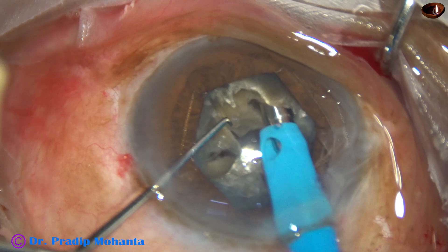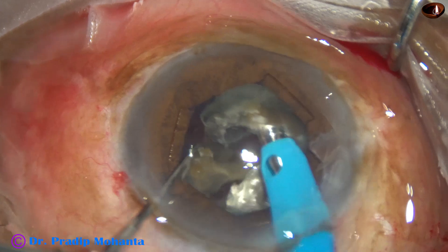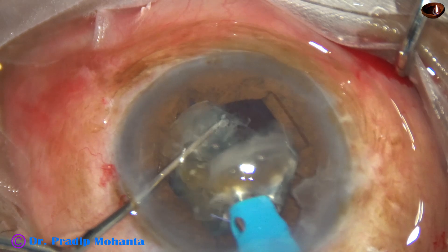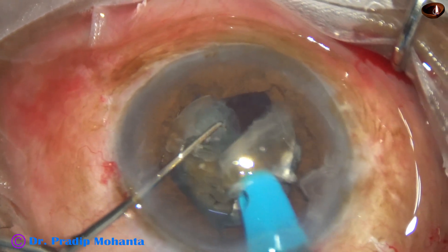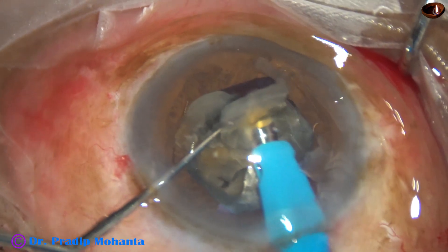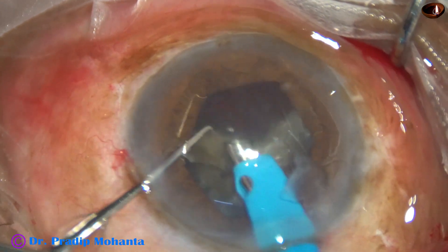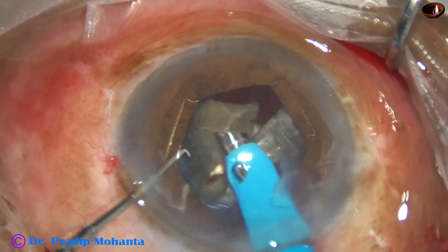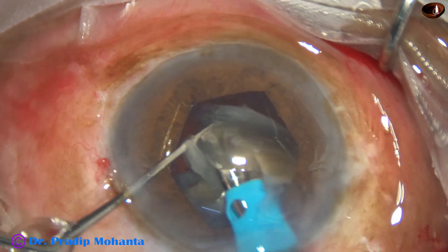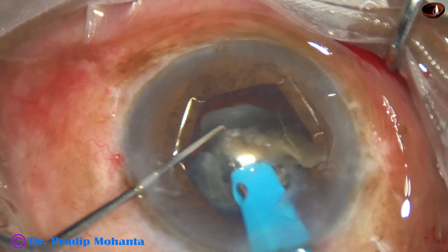Now my plan is to emulsify this nucleus. Ultrasonic energy is set at 80%, flow rate is 45 mL per minute, and vacuum is 450 mmHg. The machine is the Galaxy Pro Orbit from Appasamy Associates. This is another challenge — I have managed such cases many times with the Oertli Cataract 3, but this is a new machine, and that is putting some stress on my mind.